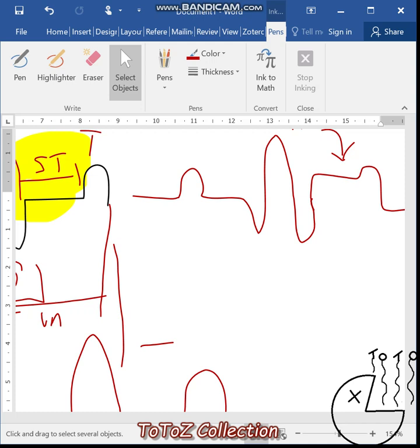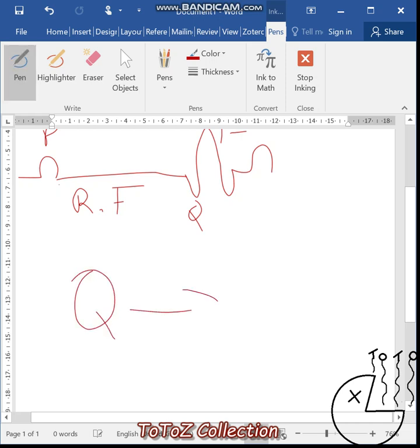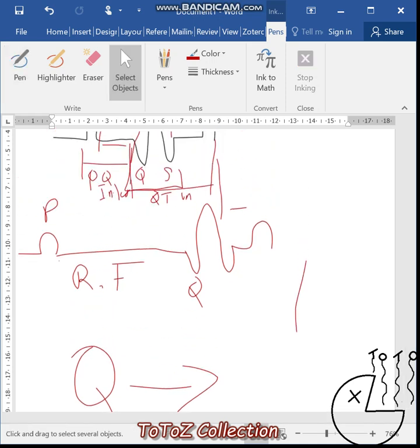And then the QT interval. How can your QT interval be affected by some conditions? Your QT interval is also going to be lengthened, as was the PQ interval. So your QT, the Q to the T, is going to be lengthened in conditions of myocardial damage or myocardial ischemia. Alright, so that's basically the gist that you have.